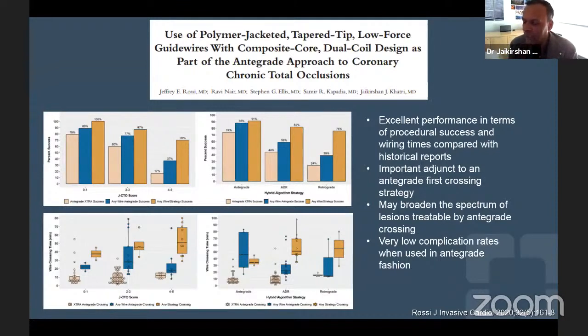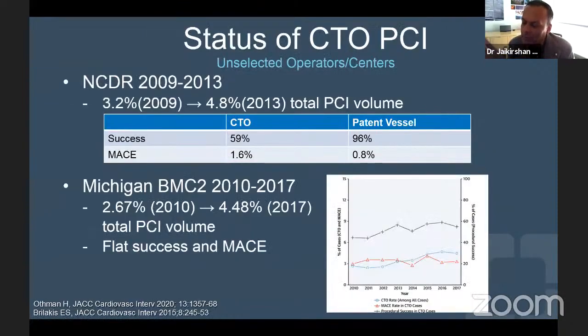And so this has changed our approach, at least in Cleveland, where we have more of an international algorithm, incorporating some of the thoughts from the Asian and European groups into the North American hybrid algorithm process. I'm going to get into more of the practical highlights of this, but before we get to that, I want to point out this one slide.